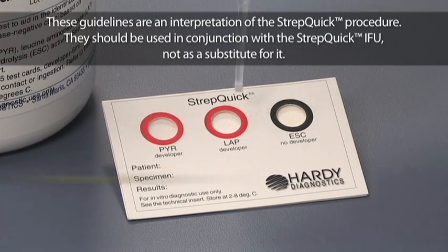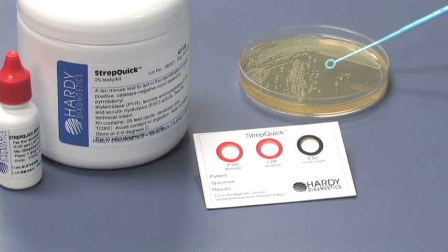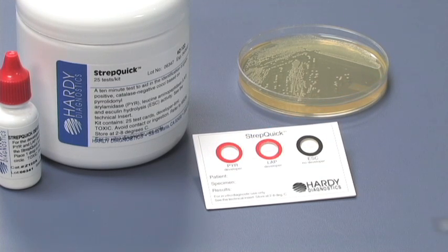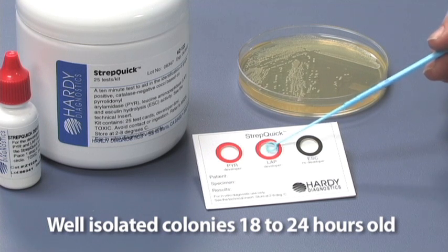Moisten each of the three reaction circles with a drop of water. Be careful to use only one drop. Inoculate a paste of your test organism on each well. Take your inoculum from colonies that are well isolated and from 18 to 24 hours old.